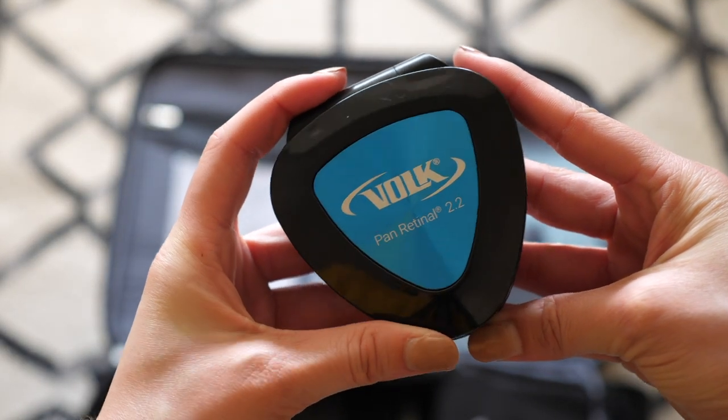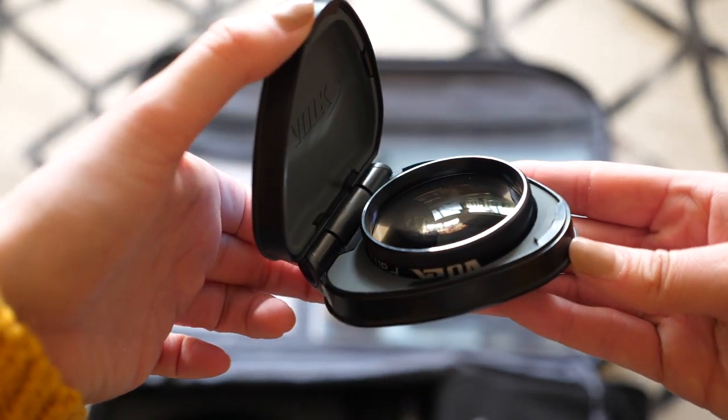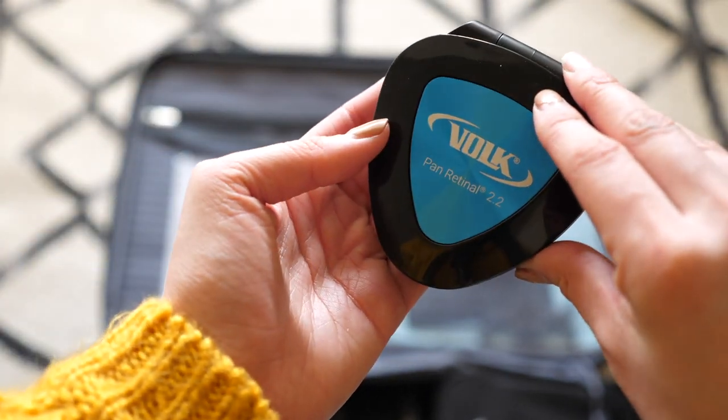I do have a panretinal lens. I don't use it a lot — I like my 20D a lot. The panretinal just seemed kind of heavy, but now that I'm better at BIO, I might do a little more of a compare and contrast and see if I want to keep it or sell it.